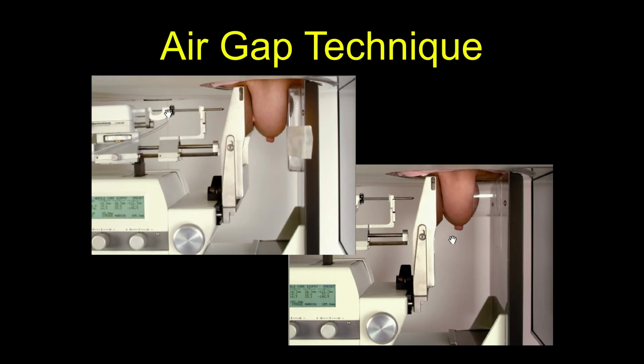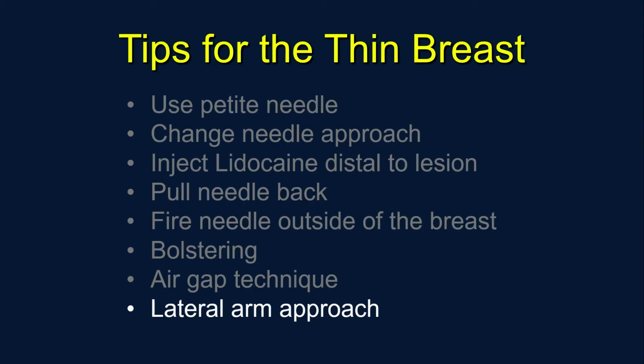It's just a hole, okay? I would say you probably should tell the patient if there's a chance that might happen, so they're prepared.